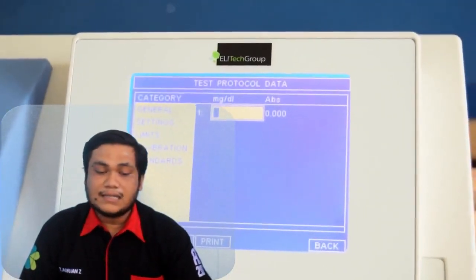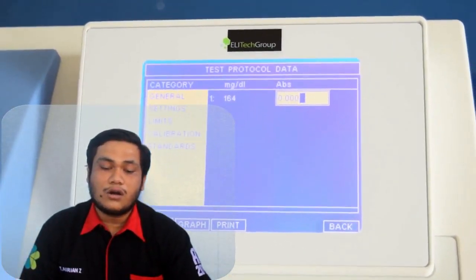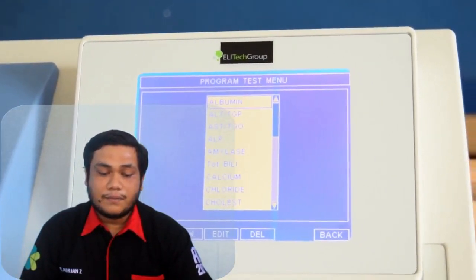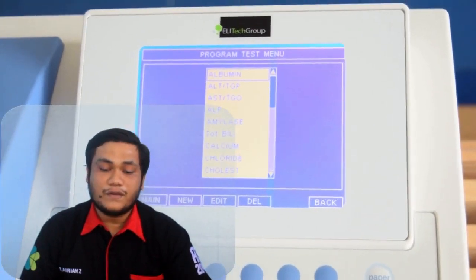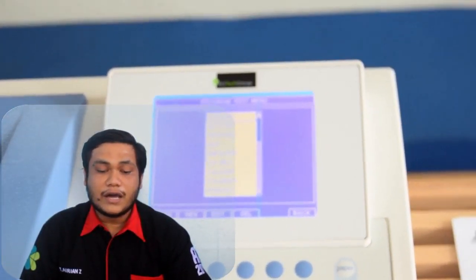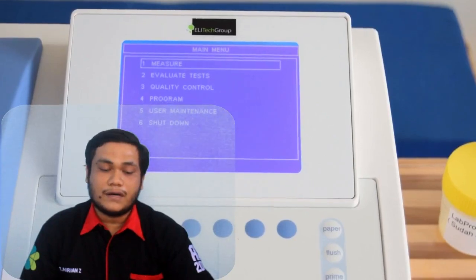Then press the on button on the soft key. The light will turn on very bright. Then press the start button on the soft key to view the absorbance of the light. If you have reached the absorbance value limit, attach the metallic cover back.